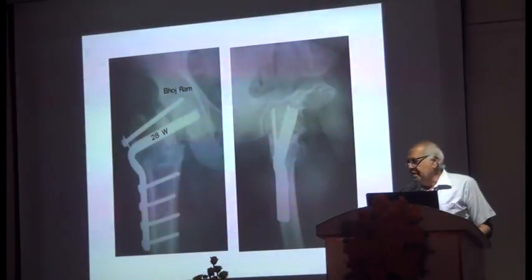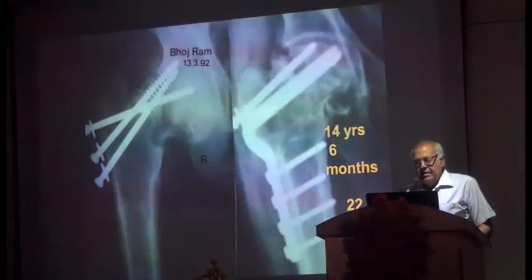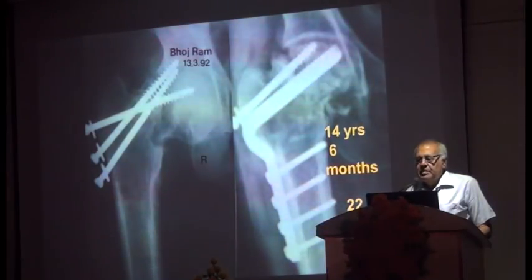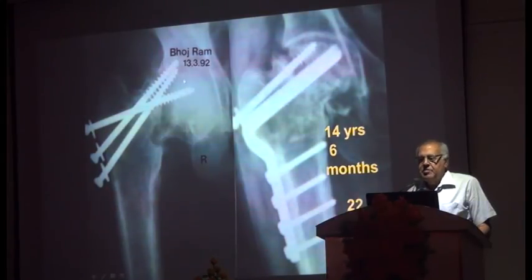This is 28 weeks. It is united. The capsule is not divided. Just valgus position. You see here, there is uniform collapse, reduced in size, united below along the calcar, not here, and this is just pre-operative.